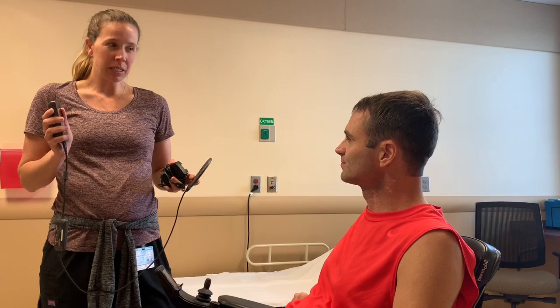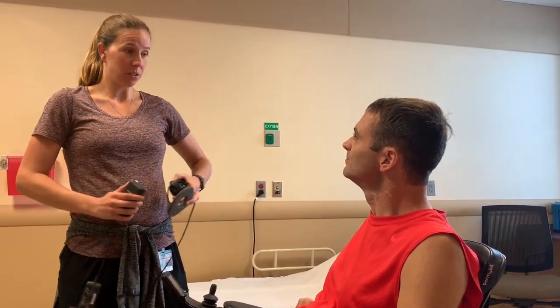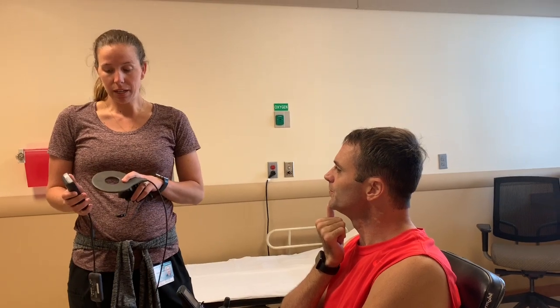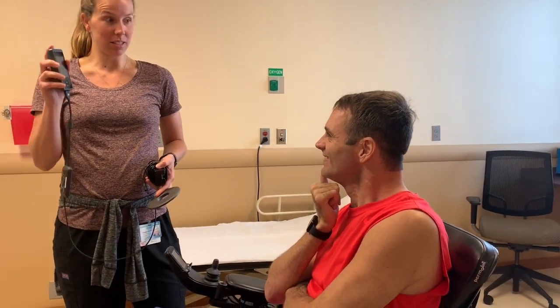And sometimes it's kind of finicky, so you might have to move into a certain position. Or there's a belt that you can strap around to help it stay in the right position. Thirty minutes is what it takes to charge? It's fast. Yeah, I think that's about it. And it'll show you the battery life of the internal battery and this device's battery.